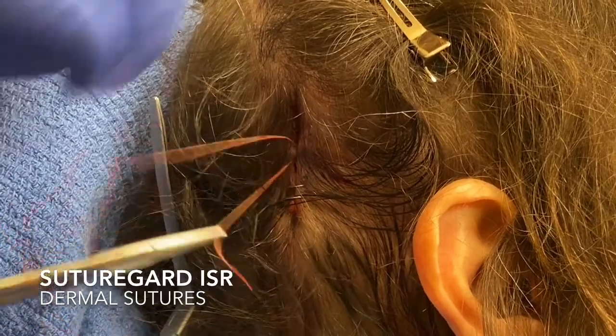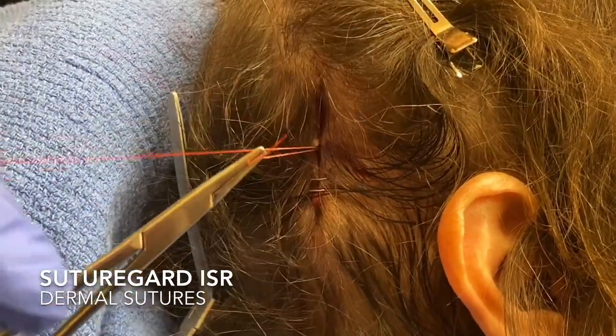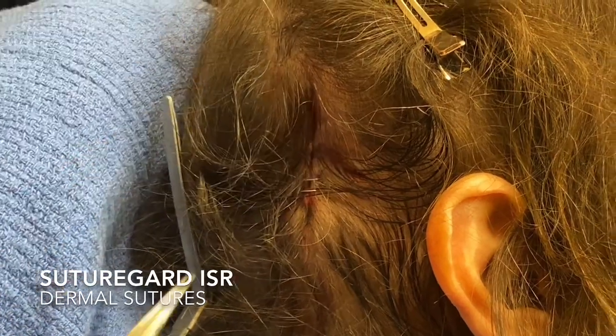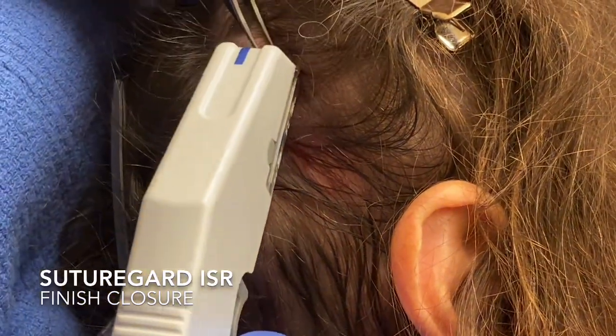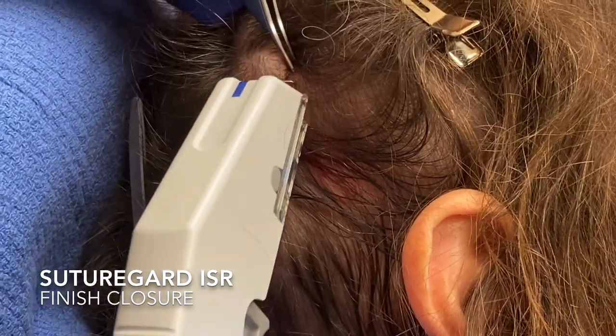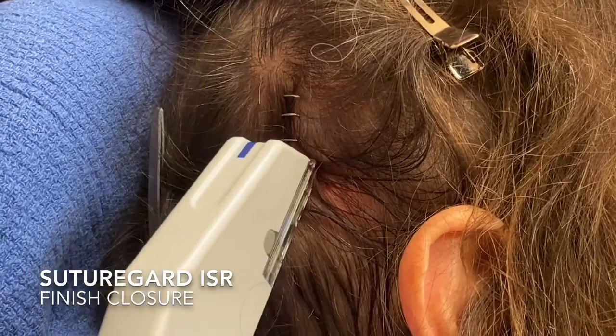Then I'll cut that off and finish the wound closure. Here I'm just going to use some staples, and I'll usually leave these staples in for two to three weeks depending on how I think the person is going to heal up, and then we're done.